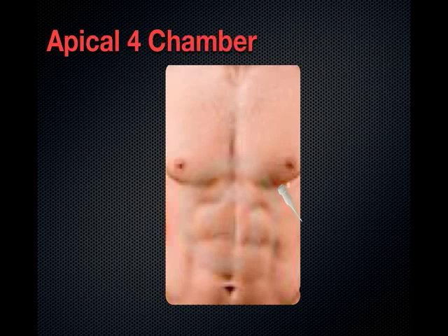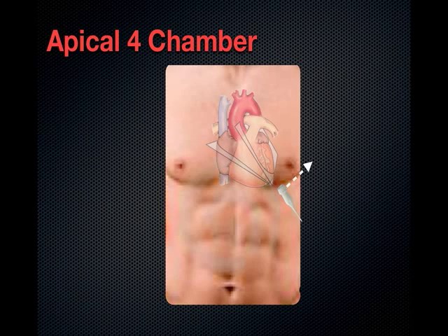I'm going to go to the apical 4-chamber views. Again, the indicator orientation marker is towards the patient's left, but instead now we're placing the probe where we would judge the patient's PMI to be. So the point of maximal impulse can be very varied with different patients. COPD patients tend to be more vertical. CHF patients can be very lateral. But feel for the patient's PMI and place the probe right at the apex, indicator mark towards the left.